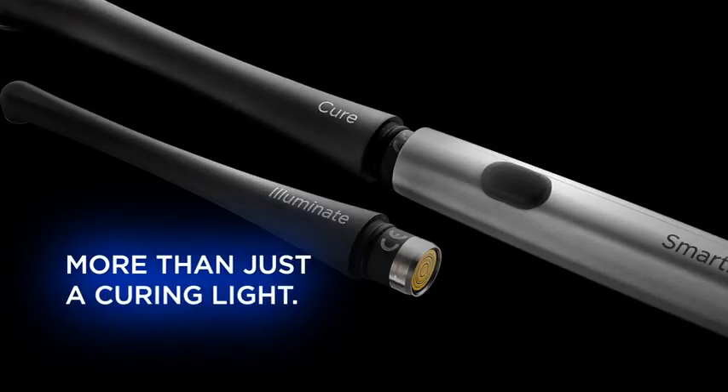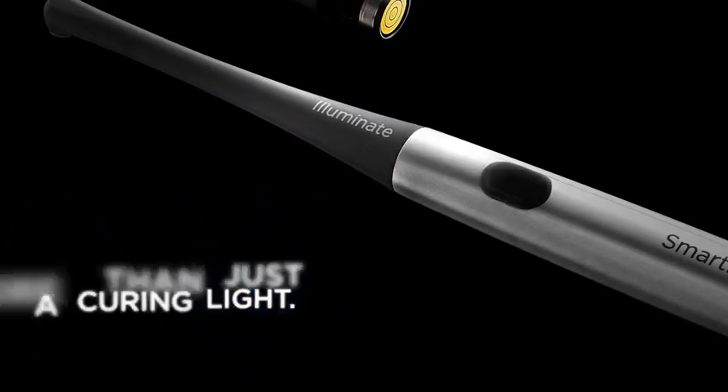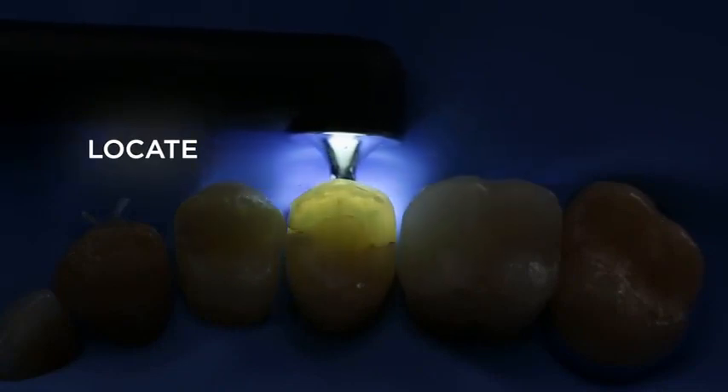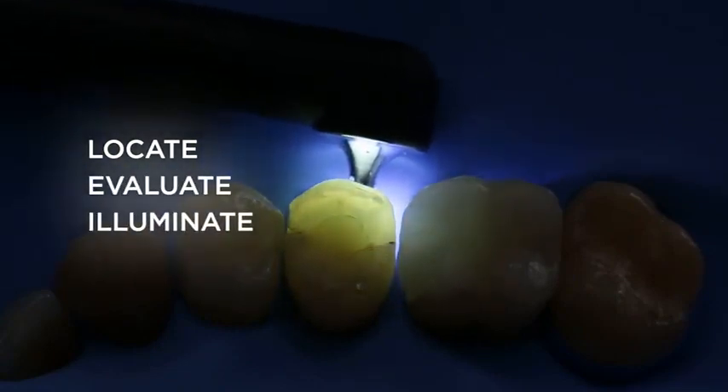SmartLight Pro is more than just a curing light. Its unique modular design features interchangeable 360-degree probes that are suitable for a variety of clinical indications. For example, its transillumination probe is a diagnostic aid that helps locate interproximal caries, evaluate cracked teeth, and illuminate endodontic access preparations.